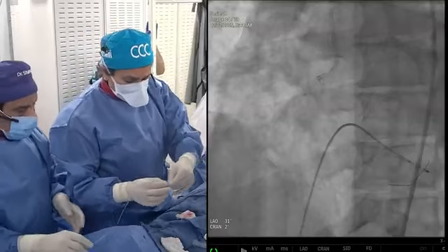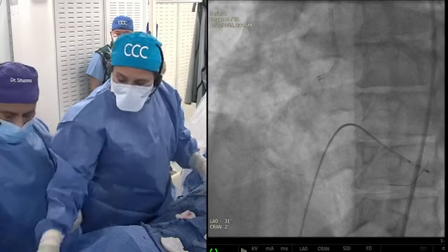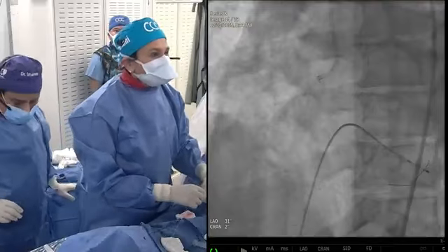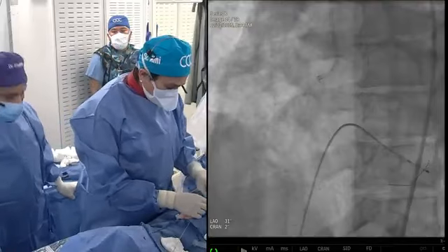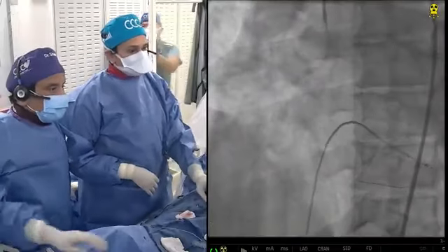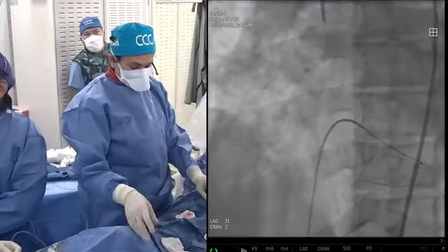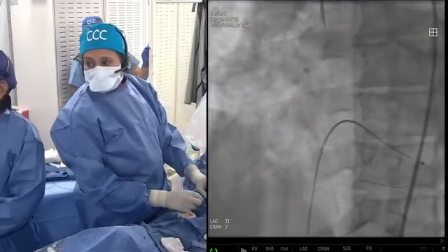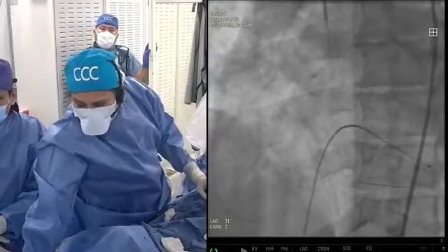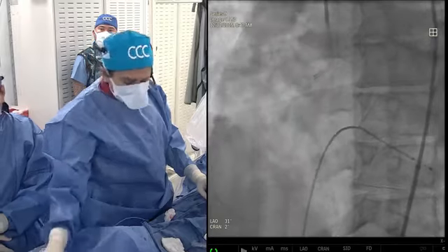So, Dr. Sharma, I presume there was no plan to burr the distal lesion, and that is why Dr. Anu chose 1.75. No, I think what is actually required is the proximal lesion. Let's see. The dry cine will tell us here. There is distal also very calcified. I would call it severe. Look at that big chunk. Could be a calcified nodule. 1.75 is bigger, but anyway, let's try. As I said, my choice was the 1.5, but this is 1.75, which is okay.